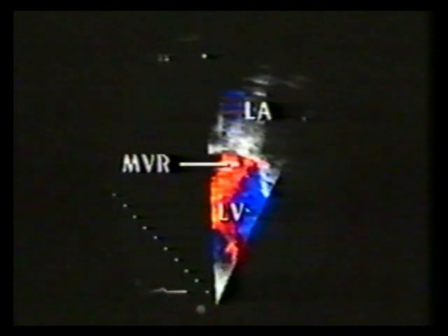This 30-year-old female also has a mitral Bjork-Shiley prosthesis. This is a normal color jet from antegrade flow across the prosthesis. In this diastolic frame, the open disc creates a small filling defect within the color map. Flow occurs through both the major orifice and the minor orifice, and then the two jets merge into one as they pass the tip of the disc.